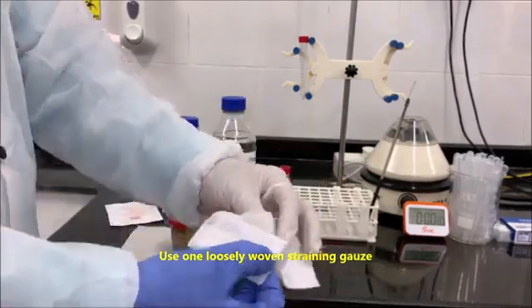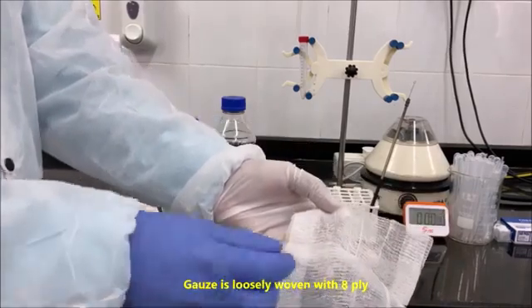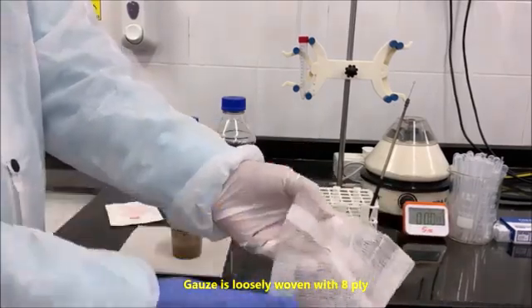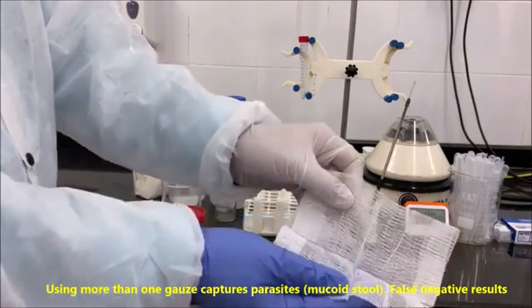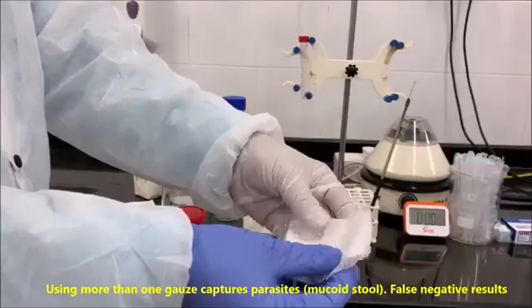Use one loosely woven straining gauze. Gauze is loosely woven with 8 ply. Using more than one gauze captures parasites, especially in mucoid stool, and can cause false negative results.